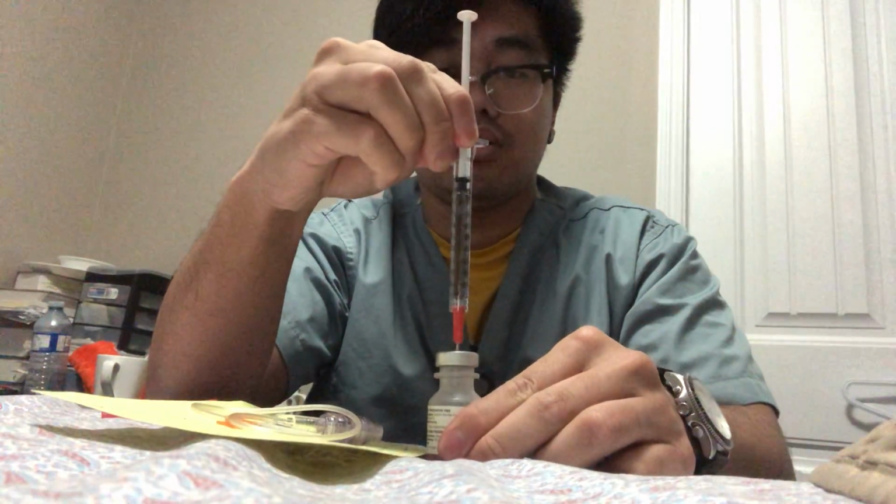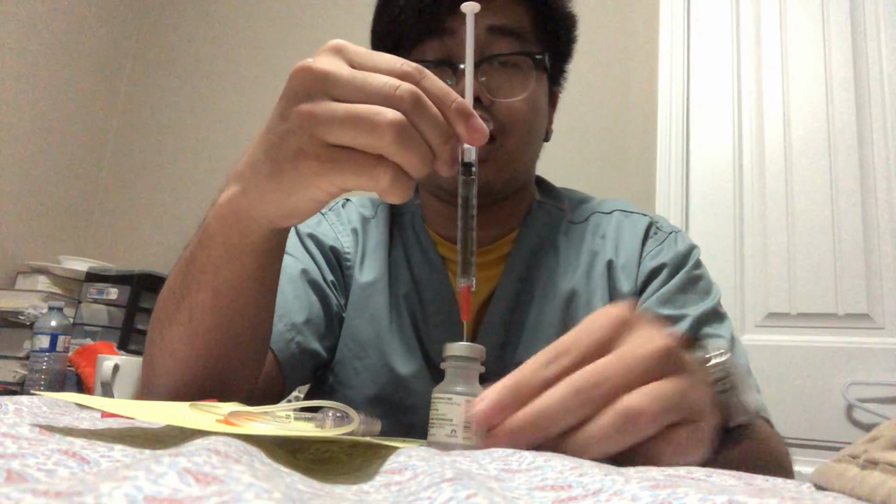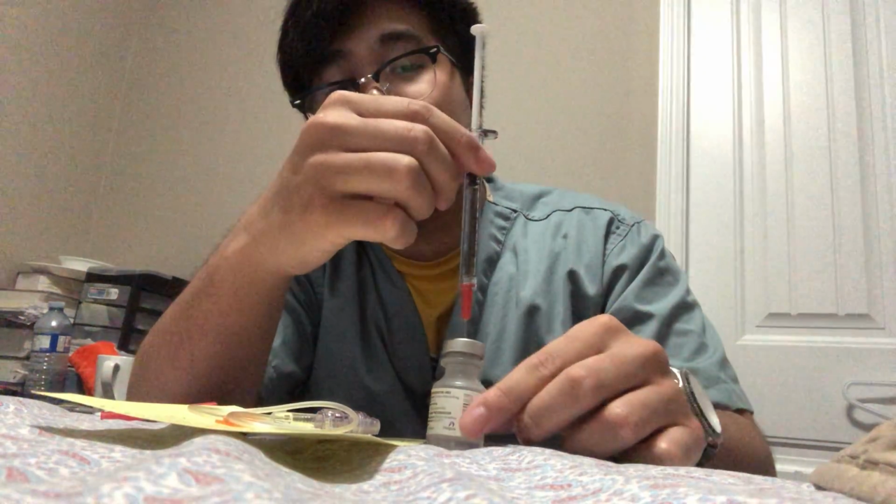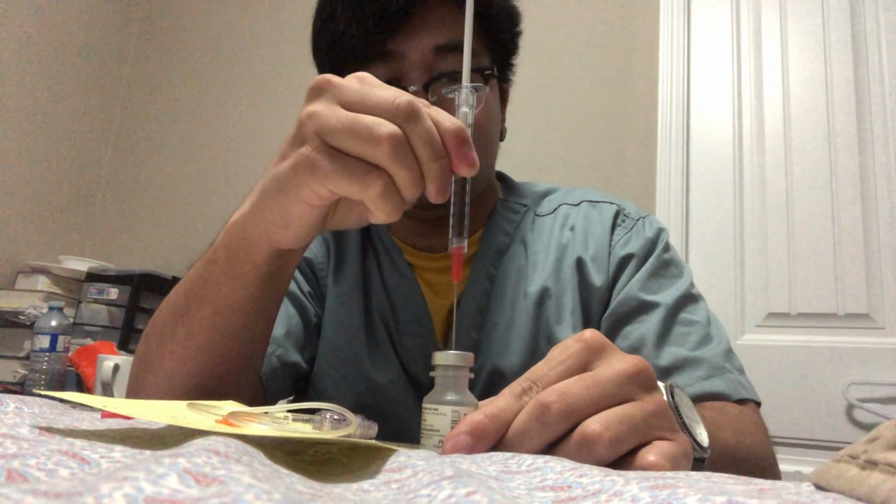Okay. I'm making sure that I'm not touching the plunger because it's gonna cross-contaminate it. Okay.